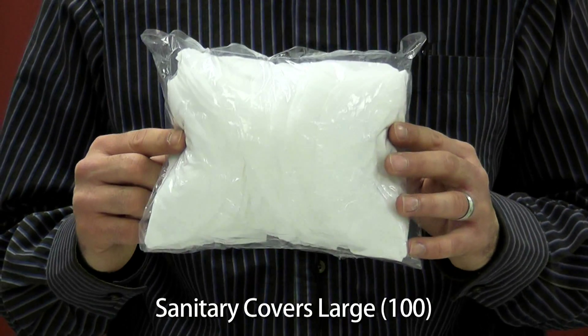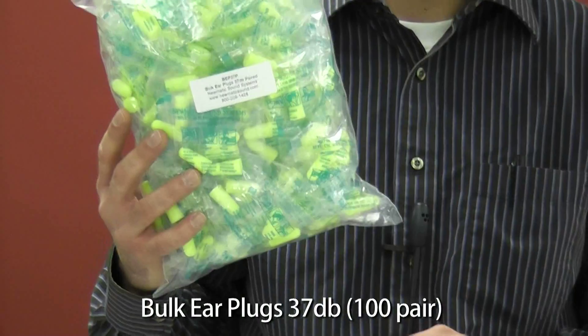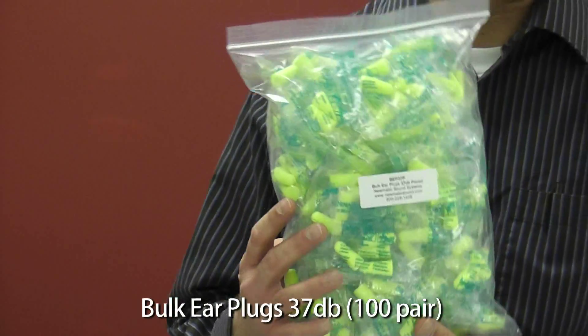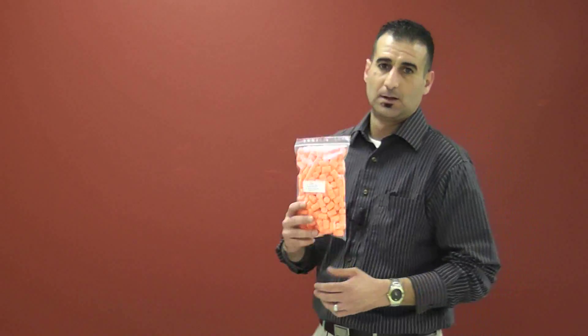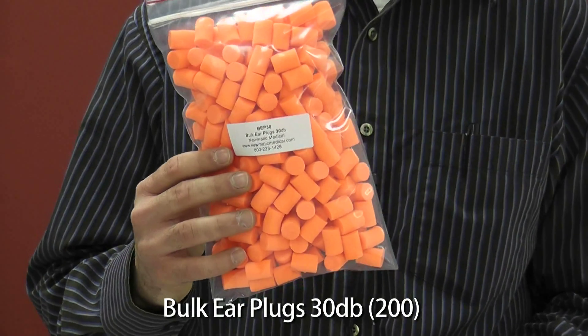To begin, you will receive one sanitary covers large starter pack, which includes 100 pieces. Next, we have our BEP37 sample pouch of earplugs, and a 200 pack of BEP30 starter pack earplugs.